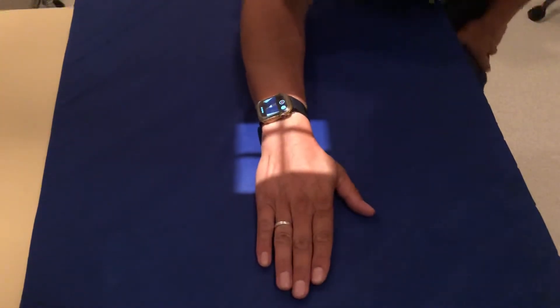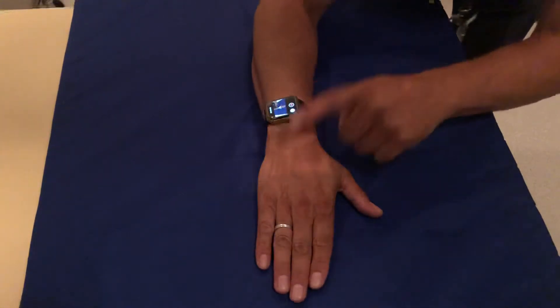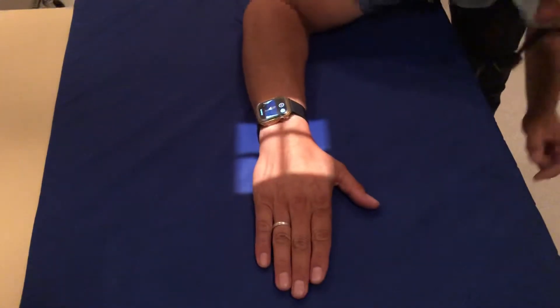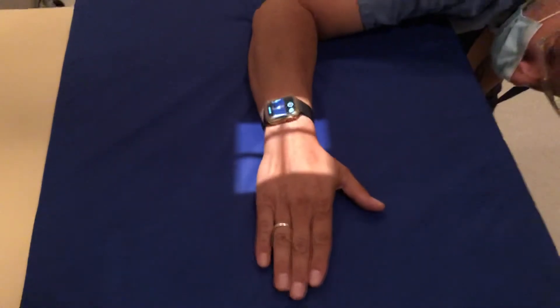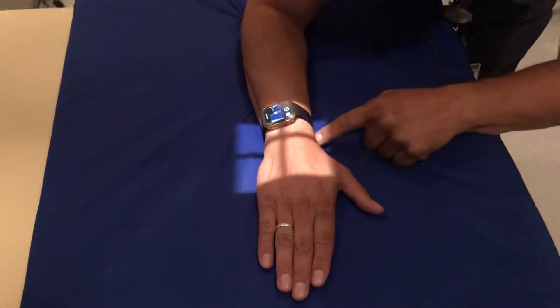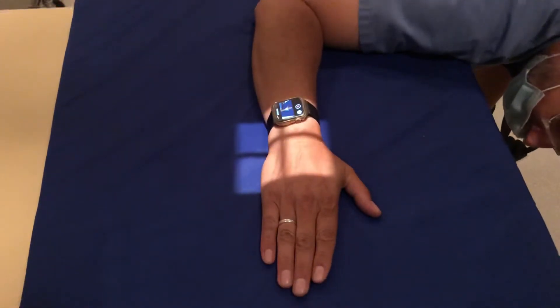So the wrist is like this for the first view. You're going to bring your hand, elbow, and shoulder into the same plane, which brings the ulna and the radius parallel to the table. That would be the first view.